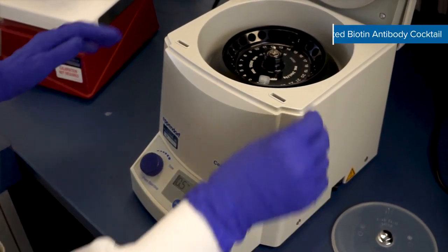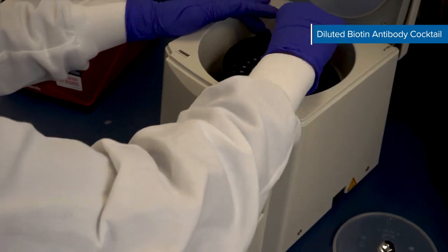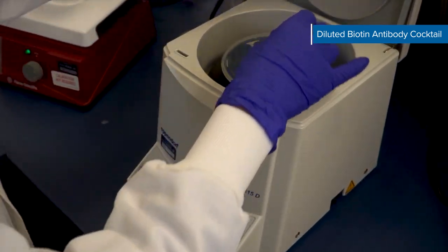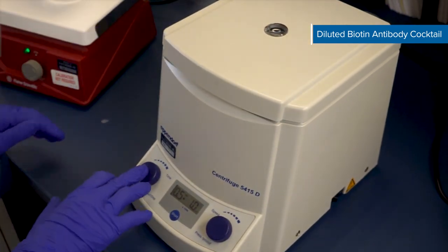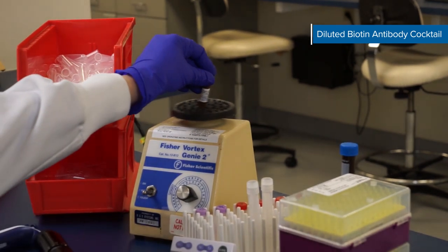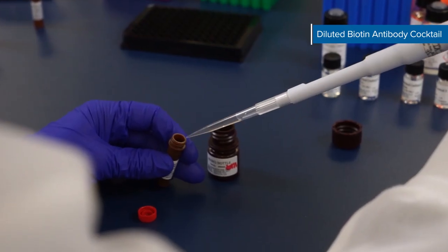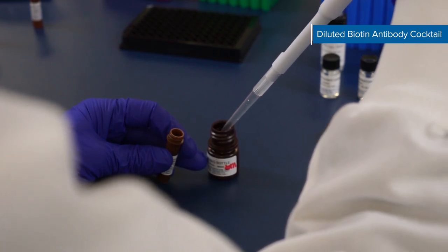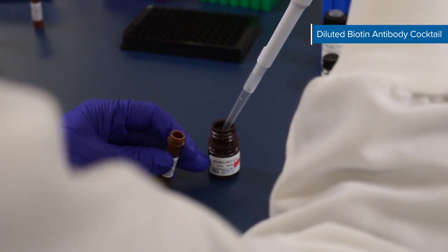Next, prepare the diluted biotin antibody cocktail the same way you prepared the diluted microparticle cocktail. Centrifuge the vial for 30 seconds at 1,000 times the force of gravity. Then gently vortex the vial without inverting it. Dilute the biotin antibody cocktail in diluent RD2-1 and mix gently. Refer to your kit booklet for specific volumes.